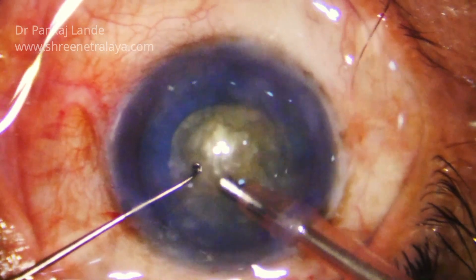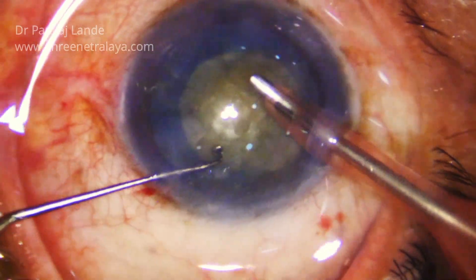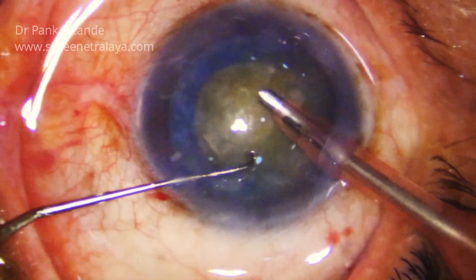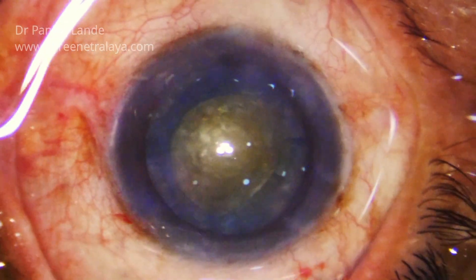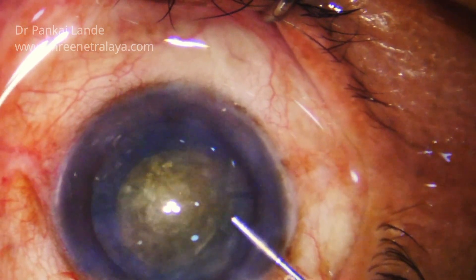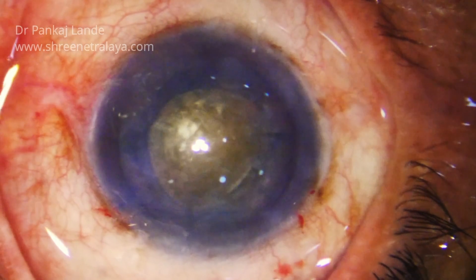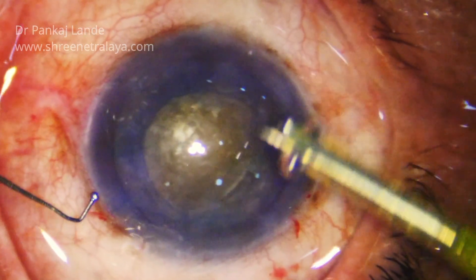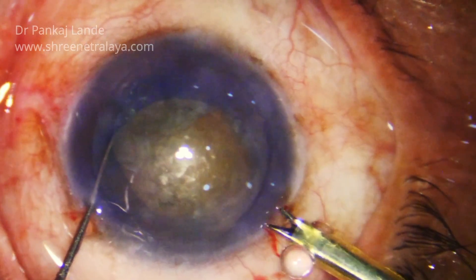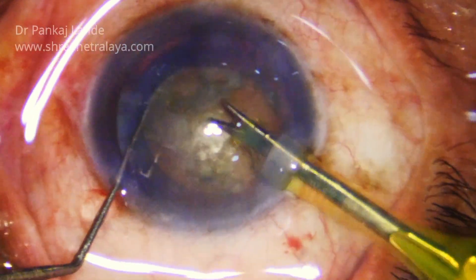I am debulking the nucleus so that I can have a better view and the cortical material will not hinder my visualisation while performing pre-chopping. Manipulation of the nucleus with the left hand is very crucial. I am using a sustainer in the left hand which has a ball point tip so that it will not injure the capsule while handling. You just have to support the nucleus with the ball point tip sustainer so that you can have a stabilised nucleus and the pre-chopper can be used safely.